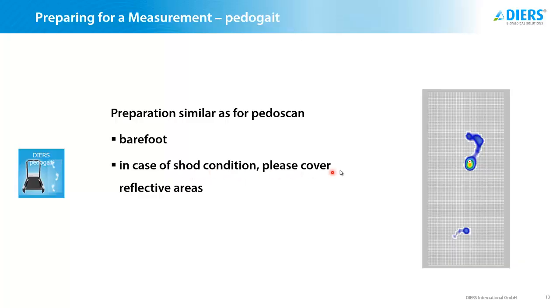If you use shoes, please cover reflective areas. Running shoes often have reflectors inside so that you're well visible when you run in the dark. But these reflective areas will hinder the automatic landmark or the automatic marker detection within our software.